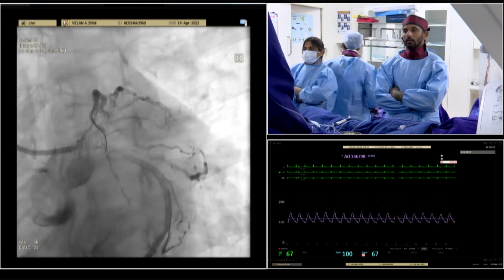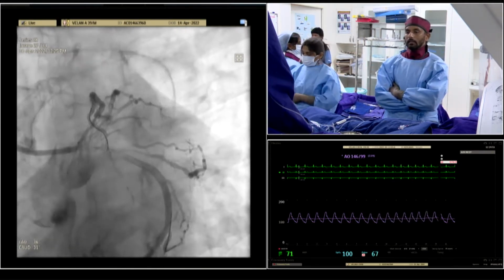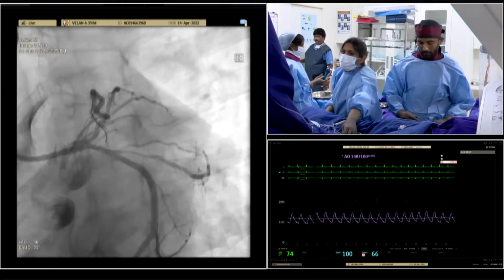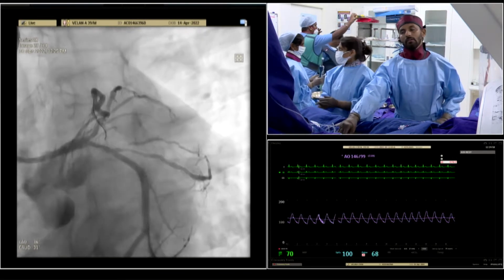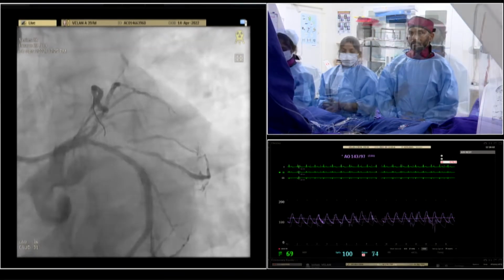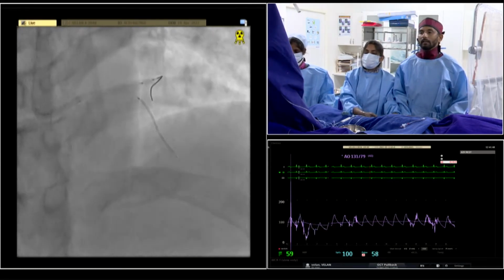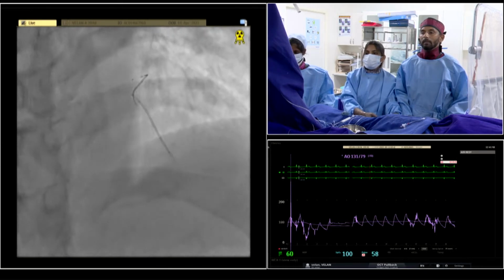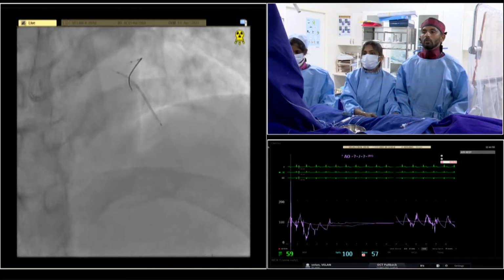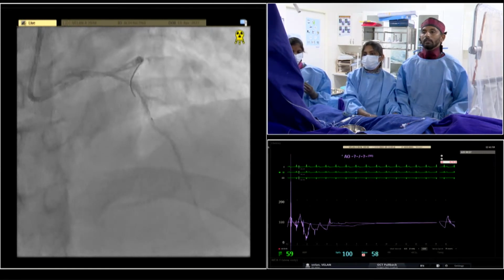The first stent we are going to put is the LAD stent, a 2.75 by 30 millimeter Onyx Resolute, coming back into the left main for us to crush. We also need a balloon ready in the circumflex to crush after deploying the stent. So we have got a stent into the LAD. I decided to go for a 3 by 30 millimeter stent, having seen the LAD in the OCT images, and I'm just trying to pull back the stent to come to the left main.